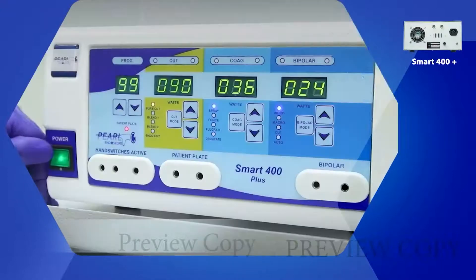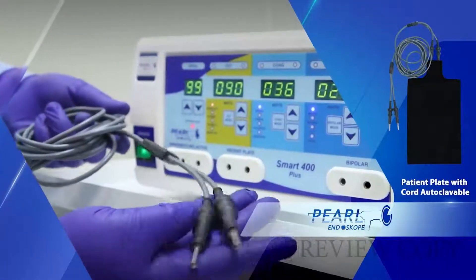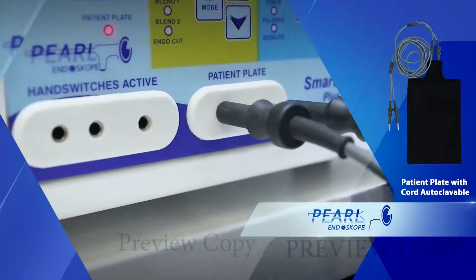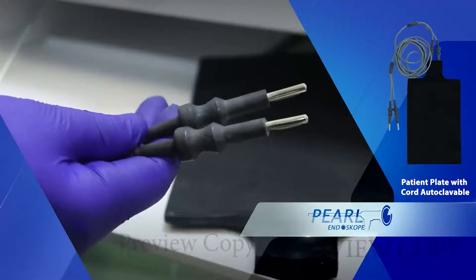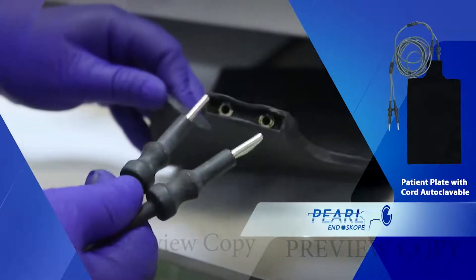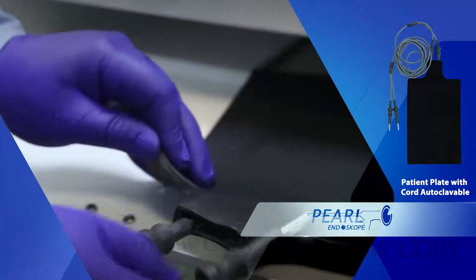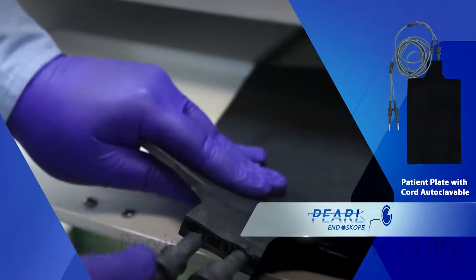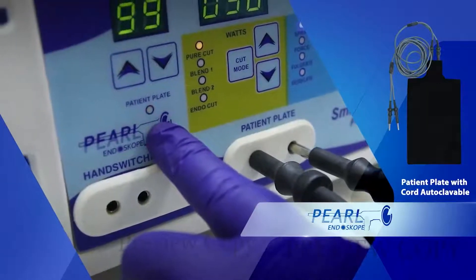The machine is switched on. This is the patient plate with cord, autoclavable, connected to the patient plate port on the machine. The other end is connected to the silicon patient plate as shown in this demonstration. This is the patient plate connection indicator; when red, it shows the connection is disabled.